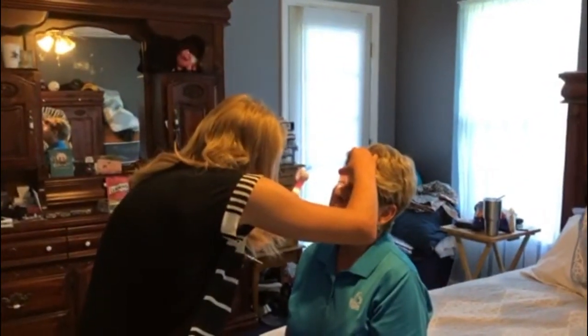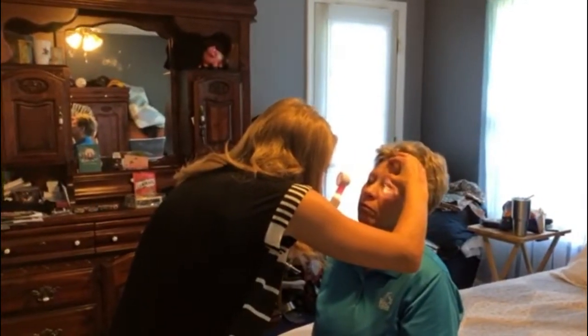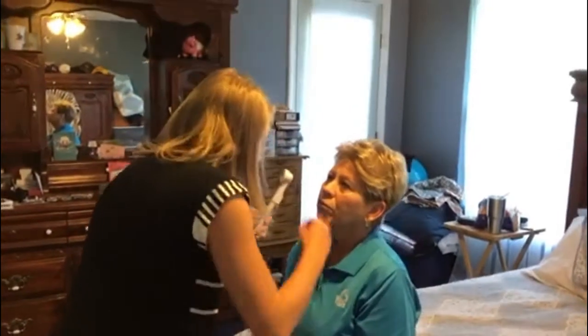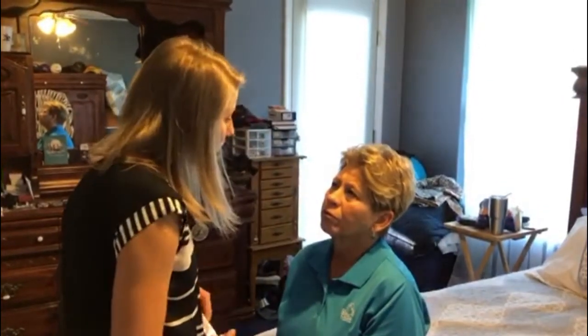I can see the outline of her optic disc in both eyes. It is orange, which is a normal finding. I can also see her macula, which is yellow, which is also a normal finding. I can also note the depth of her anterior chamber, which is about 3 millimeters, which is also a normal finding. And now we will go ahead and move on to your ear exam.